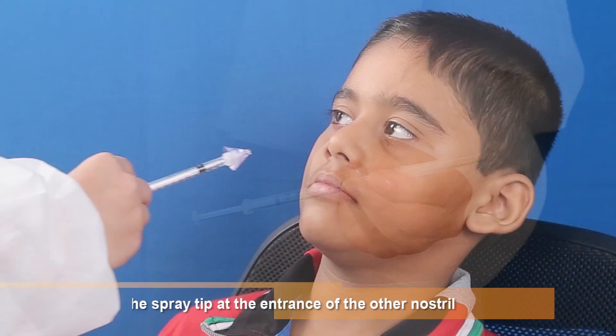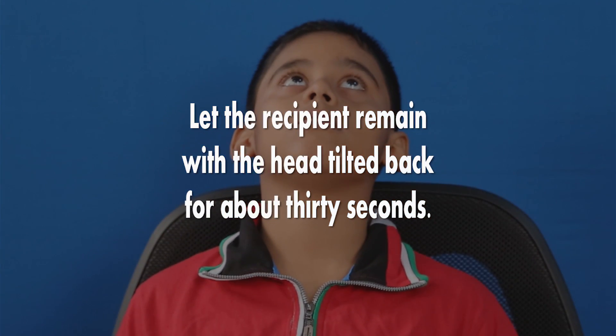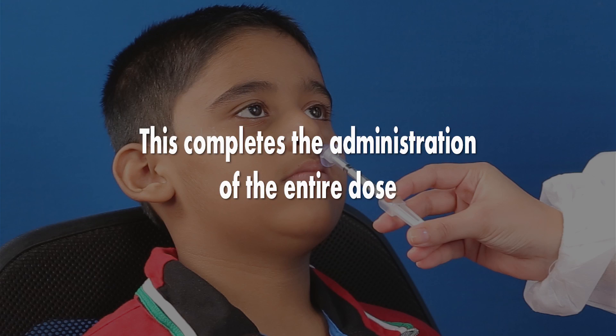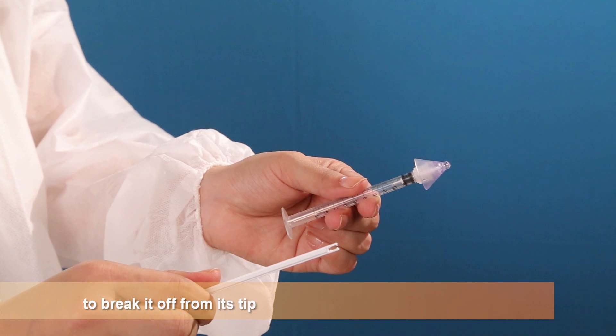Remove the dose divider. Place the spray tip at the entrance of the other nostril. Let the recipient remain with the head tilted back for about 30 seconds. This completes the administration of the entire dose. Disable the syringe by pulling back the plunger to break it off from its tip.